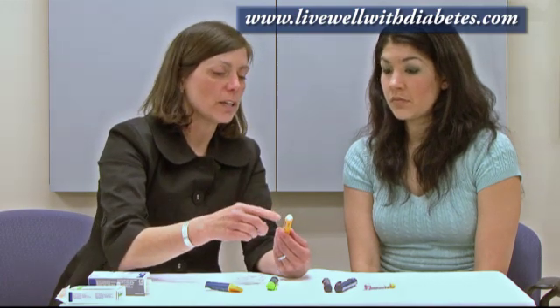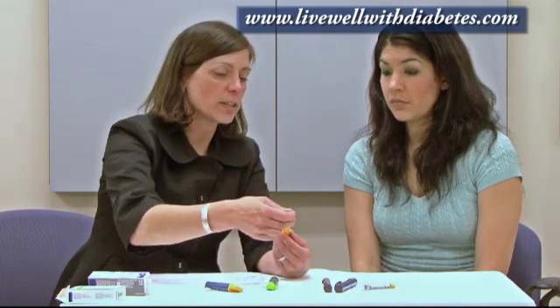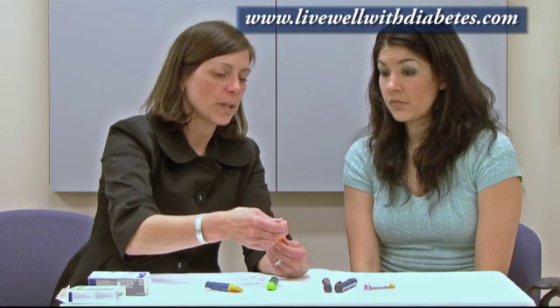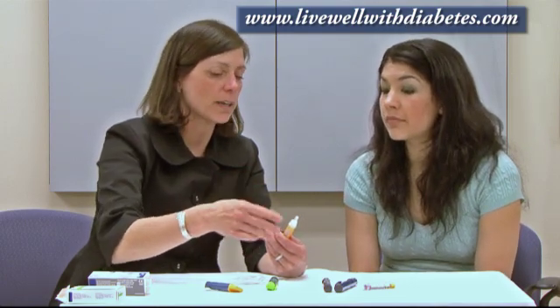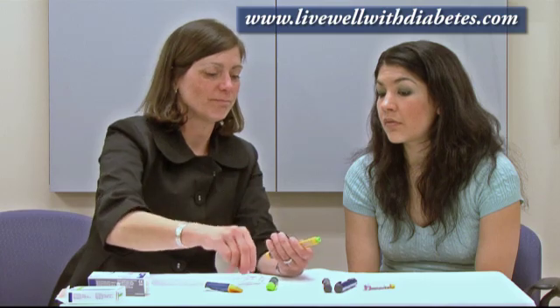The other important feature is that after each injection, it's important to detach the needle. If you leave a needle on, it can get plugged, or air can enter into the cartridge, which you don't want. So always detach the needle after each use.